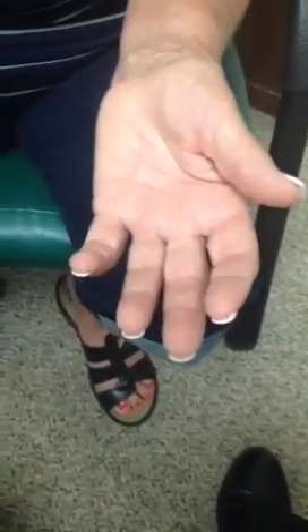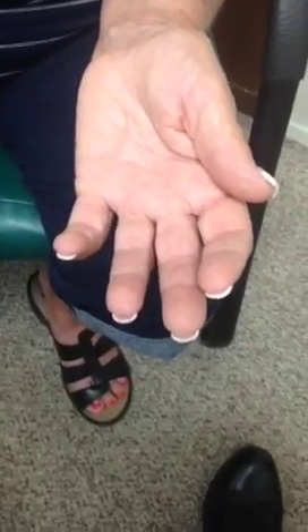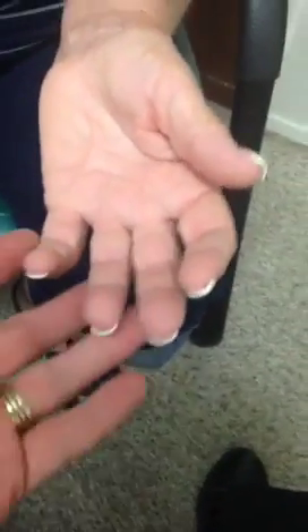Welcome to the Dr. Von Periscope and we're going to show you a trigger finger injection. Right now you see our patient's hand. Can you demonstrate what your fingers do so they can see how they don't curve all the way?